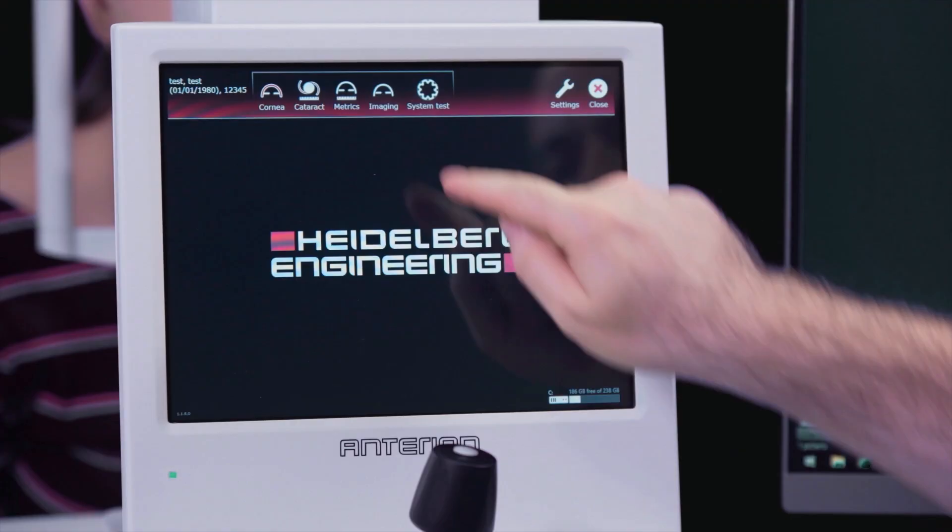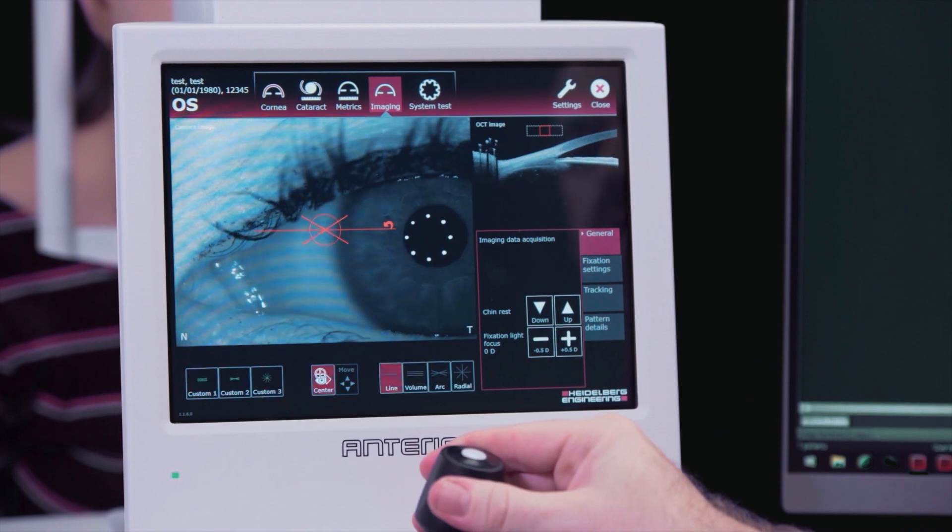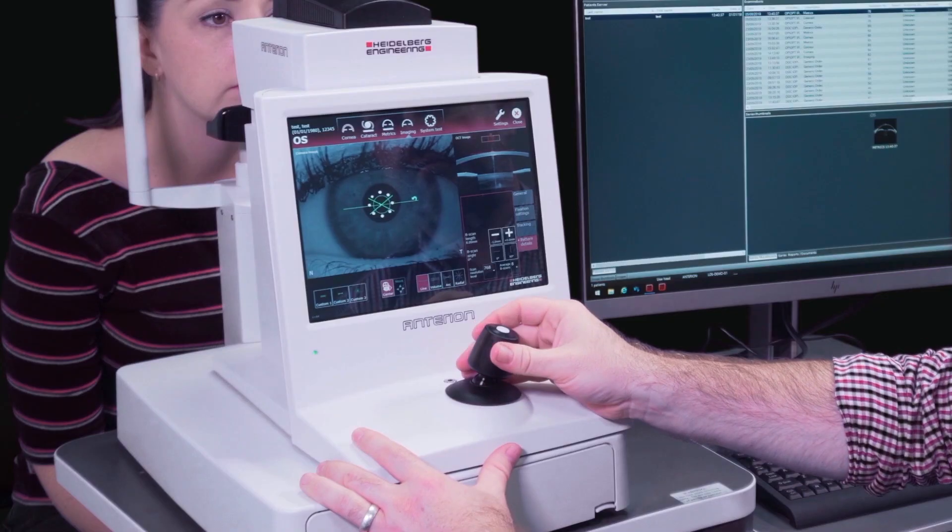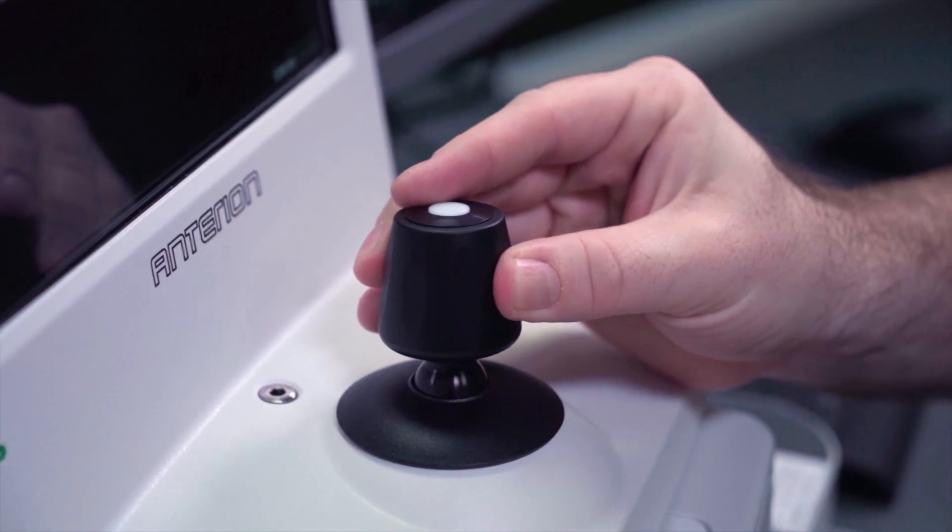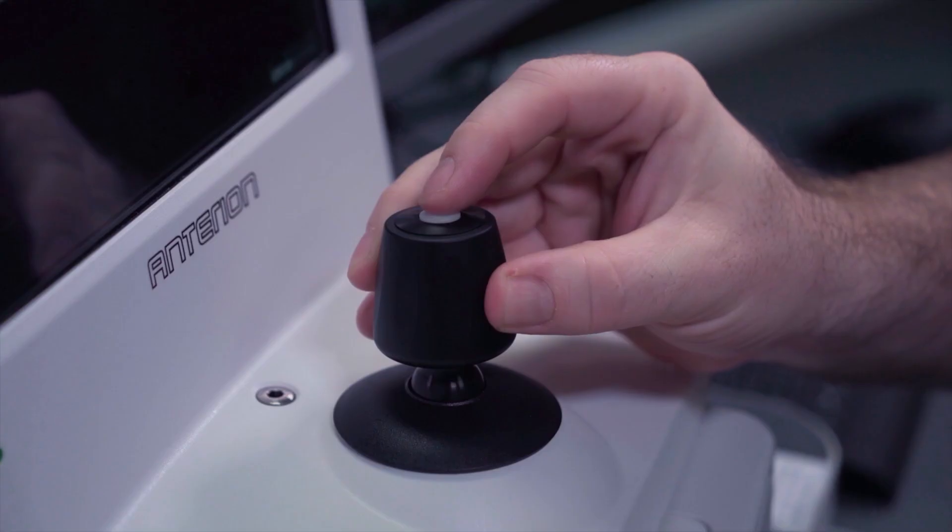Select the imaging app. The imaging app defaults to a single 8mm line. Align the patient in the camera image and OCT image windows. Ask the patient to blink before acquiring.